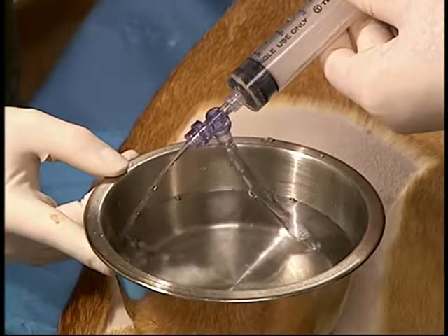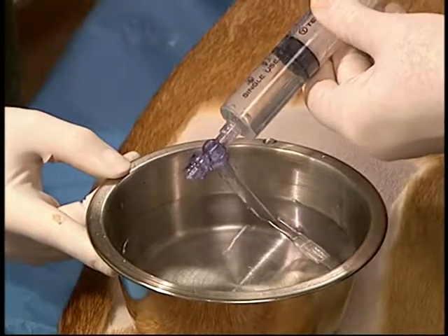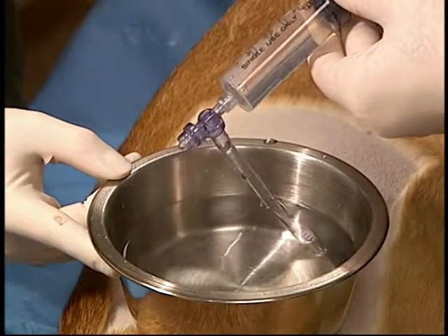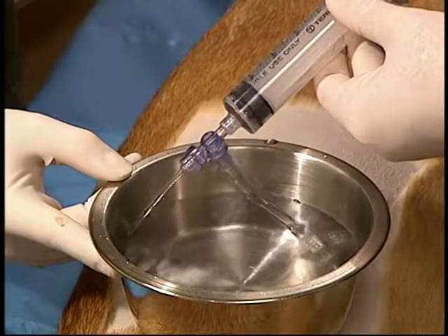The adapter is attached to the needle or to a catheter. Fluid or air is aspirated from the pleural space, and then as the plunger of the syringe is ejected, the fluid is ejected out of the other port.